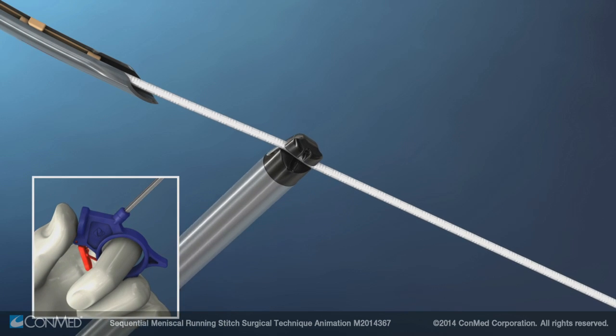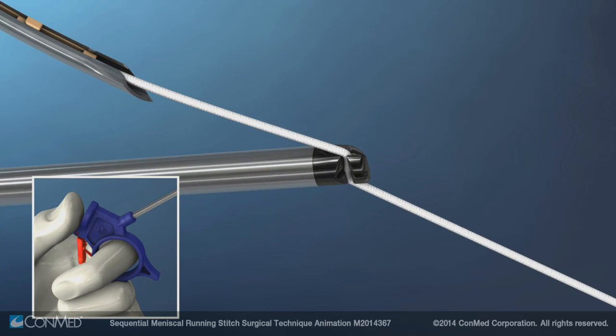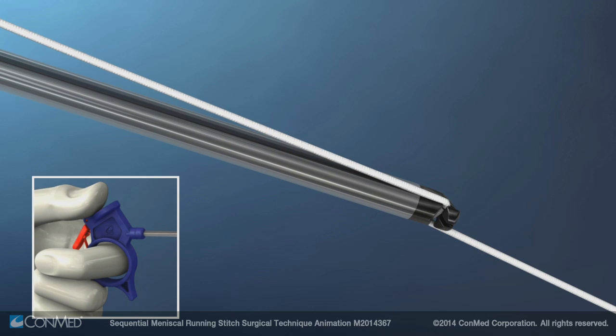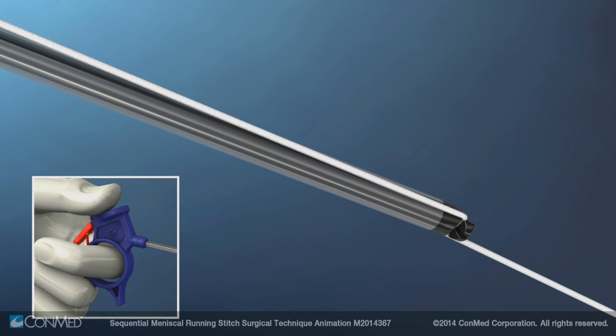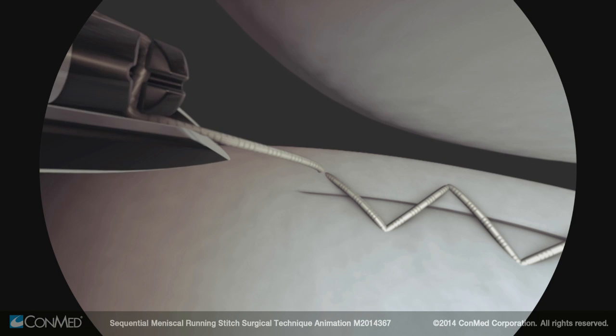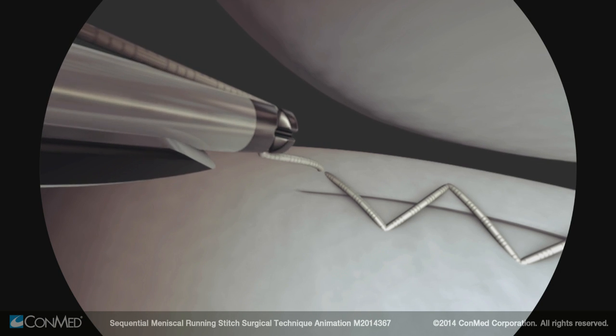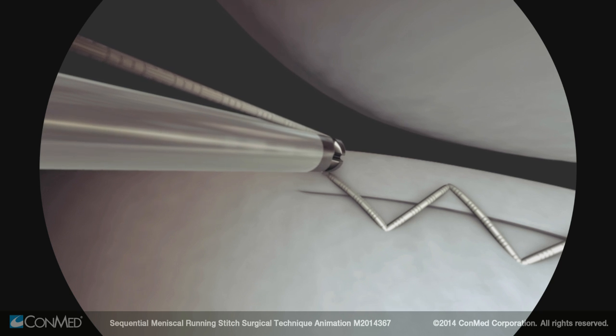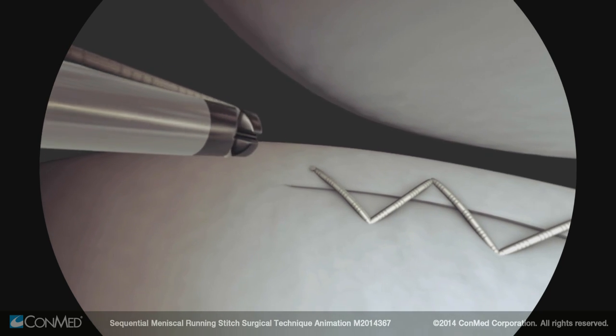Rotate the cutter shaft to align axially with the suture. Keep the thumb resting on the blue thumb rest and keeping the suture taut, slide the suture cutter down the suture. The entry cannula facilitates easy entry of the suture cutter into the joint. When ready to cut the suture, press the red lever.